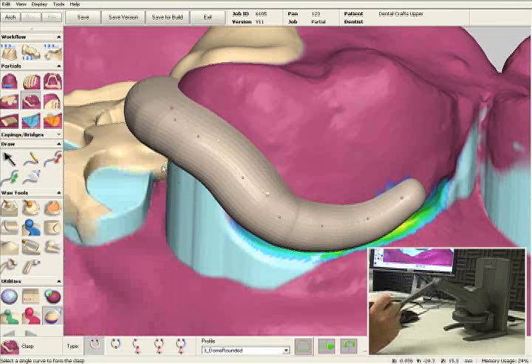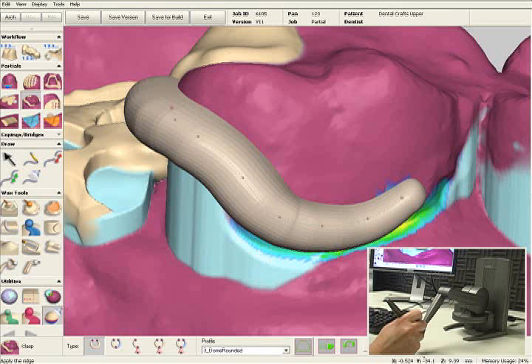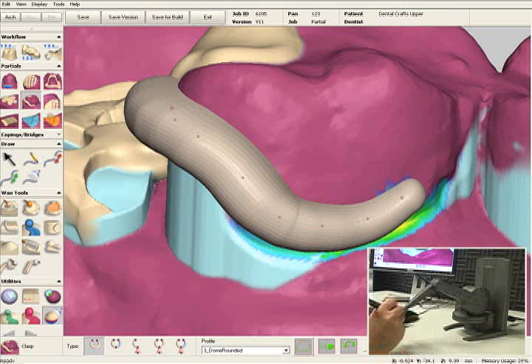Once you're happy with the way the clasp looks, we'll click the apply button, which will turn it from the three-dimensional preview to our digital wax.